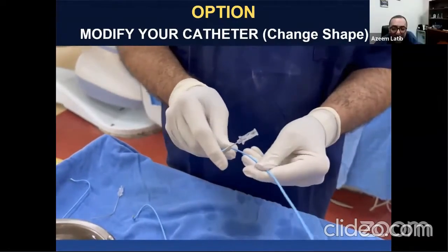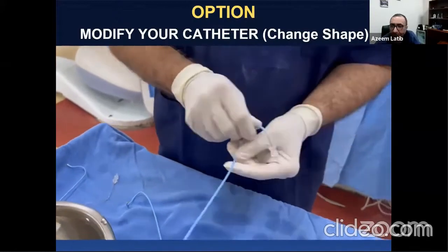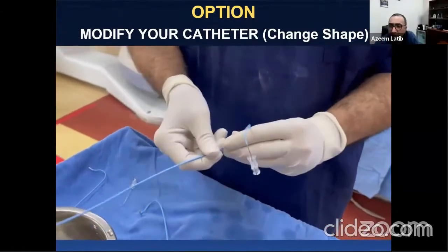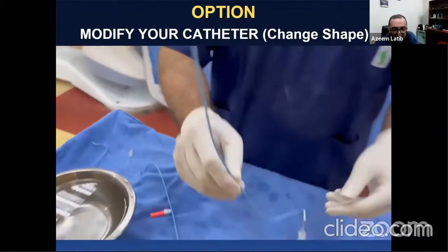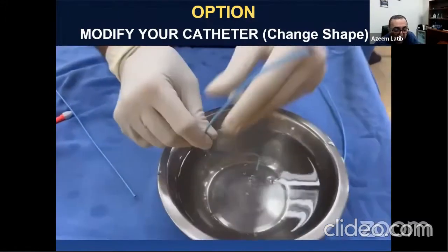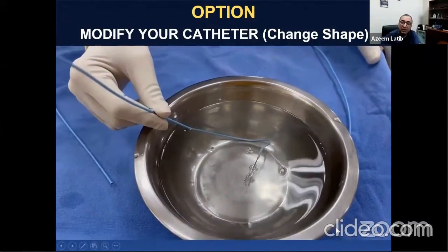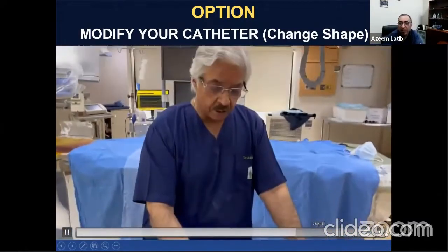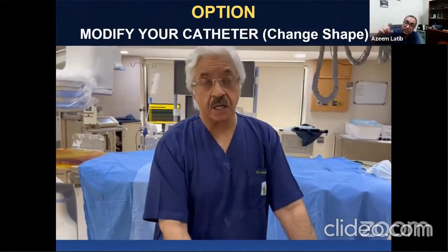Okay. And these look like Cordis guiding catheters. Yes, these are Cordis guiding catheters. Have you tried it with Medtronic guiding catheters by any chance? Yes, I have, and it does the same. We're going to try this soon because we've been doing a lot of BASILICA recently, and we tend to use an oversized AL, so AL2, AL3, but at the tip we needed to face even more downwards, away from it.